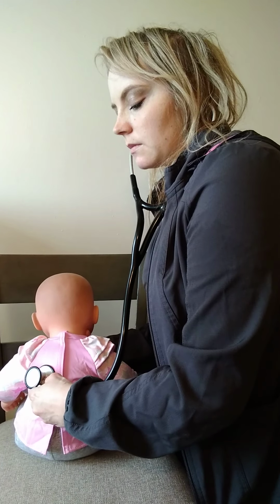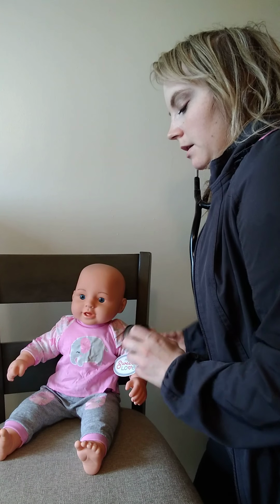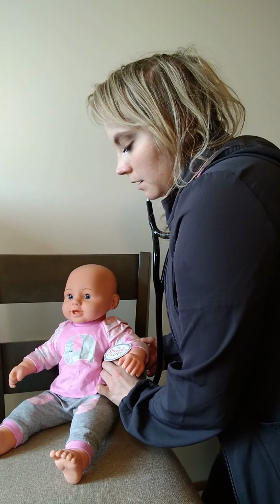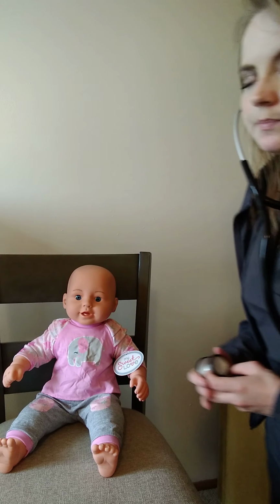Okay, sounds normal. Then I'm going to listen to breath sounds on both sides, axillary, the subaxillary. Have the patient lift their arm and listen in. Okay, sounds good, both sides.